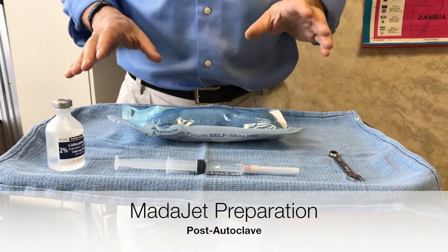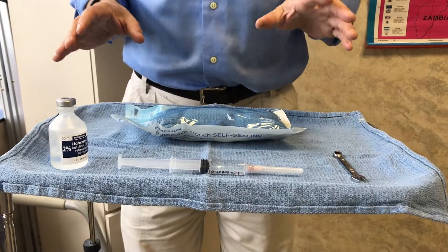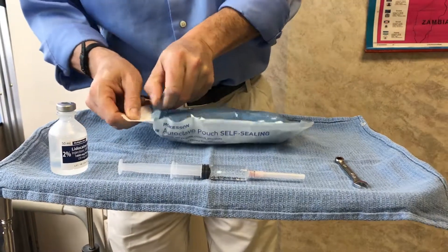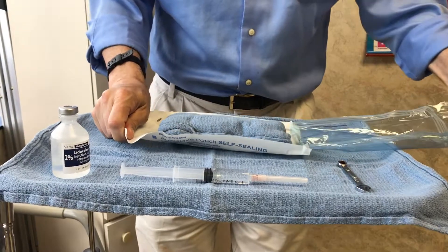The setup of a MataJet. This MataJet could be either right out of the box as a brand new unit, or it could have been used yesterday. The point is that it's been sterilized. This is the setup of a sterilized MataJet.